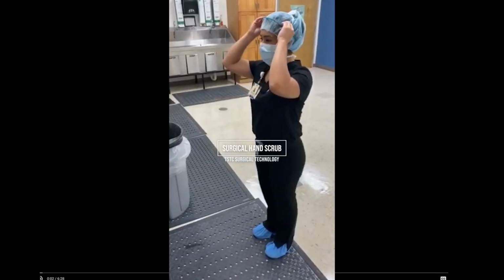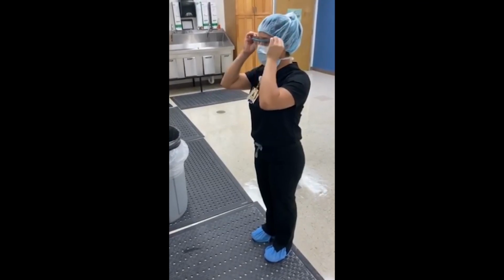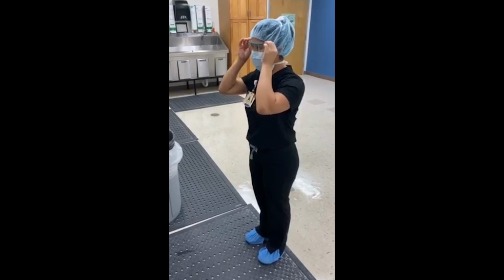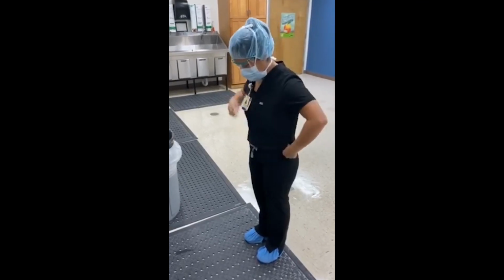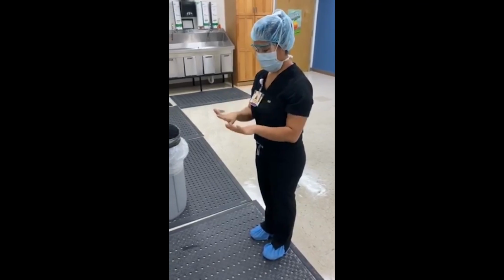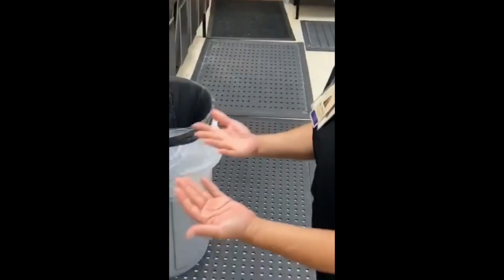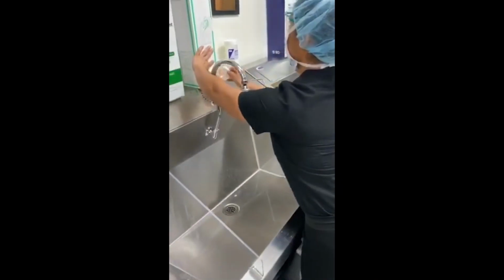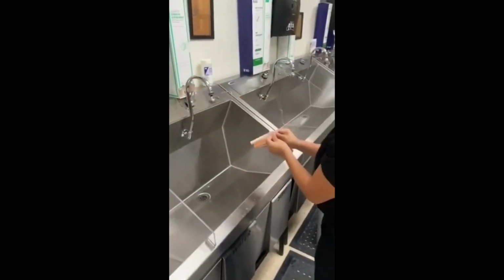Okay, so first approaching the sinks to get ready and prepare going into the OR. She is checking for all PPE. Again, that includes the bouffant, your surgical mask, eye covers or eye protection, and shoe covers. A quick brief of your hands and arms to make sure there are no abrasions.